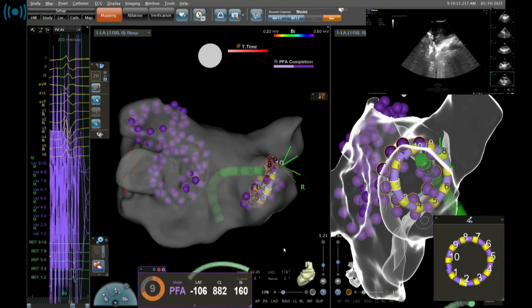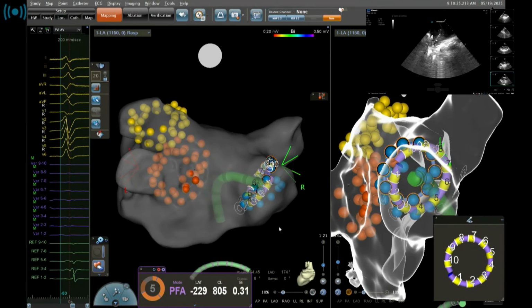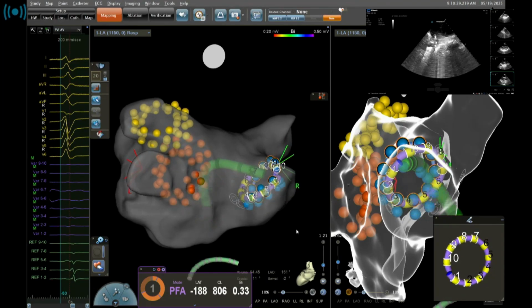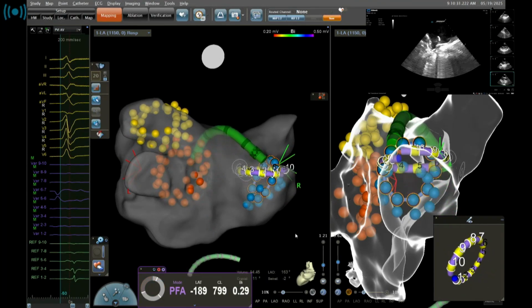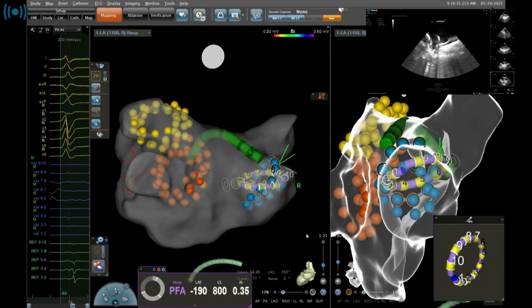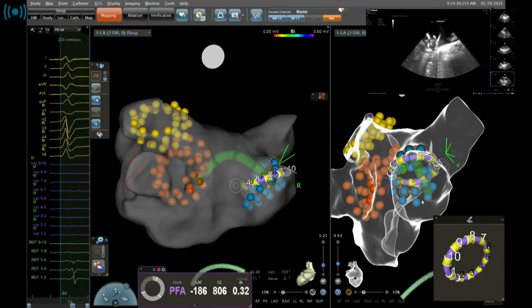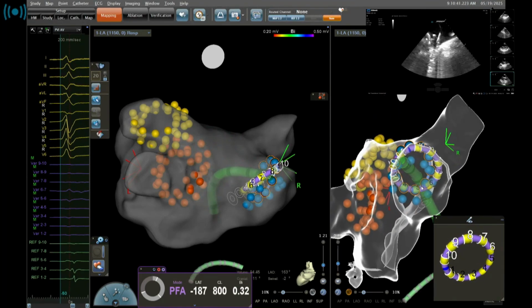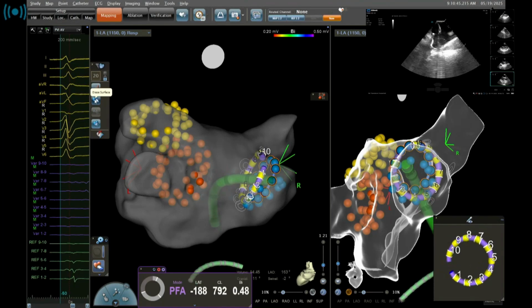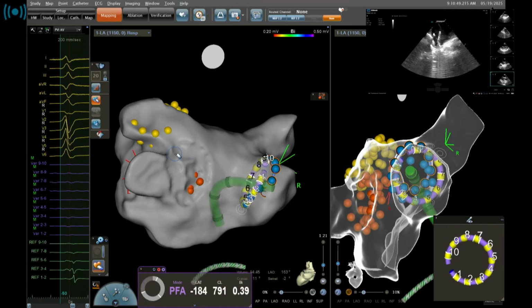Okay. Now I open. Of course, when the right inferior vein is flat, is small, it is a little bit more difficult. Now I push the long sheath in order to pull back a little bit the catheter, and I go out. I open the circle. Okay, now I'm outside. You see?